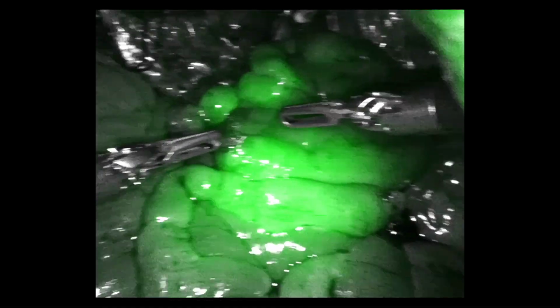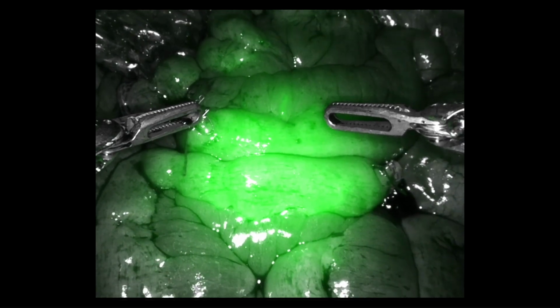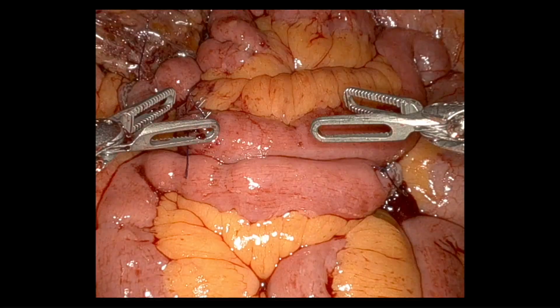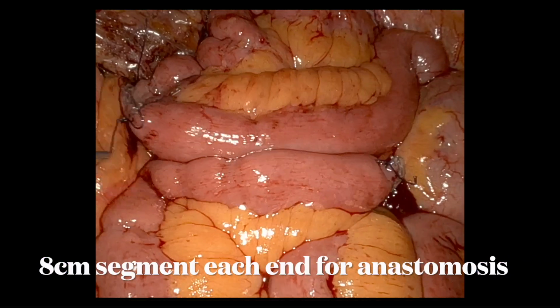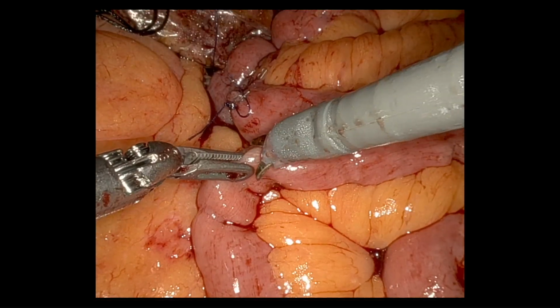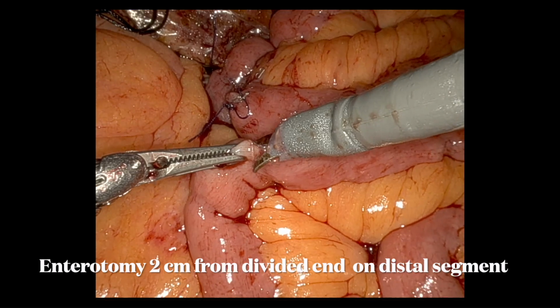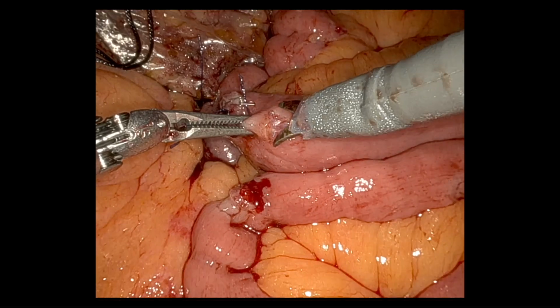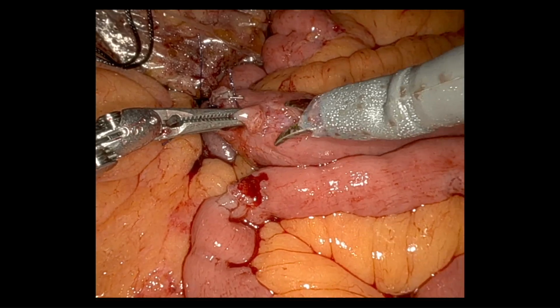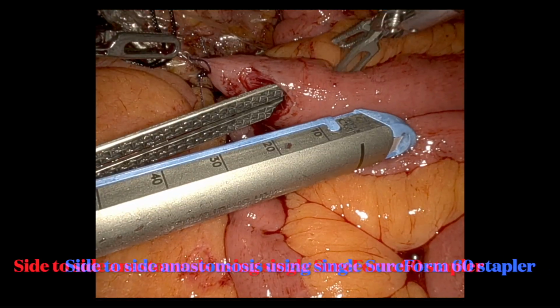We take 8 cm of overlap of the distal and proximal bowel segments, and we make an enterotomy in the proximal end at 8 cm from the divided end, followed by an enterotomy in the distal end around 2 cm away from the divided end. We leave 2 cm of the segment away from the stapler line to minimize ischemia.